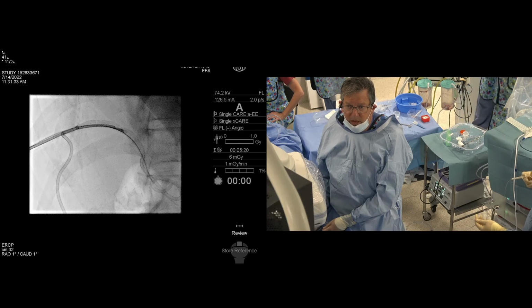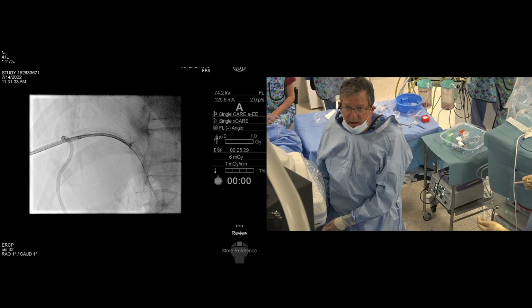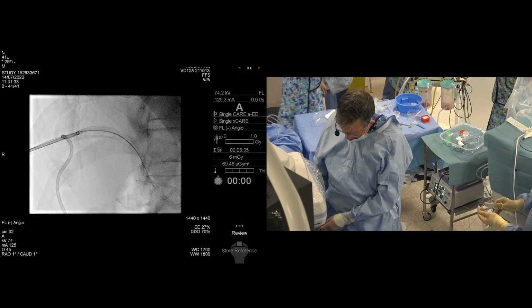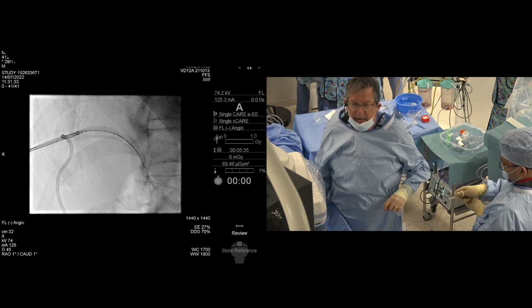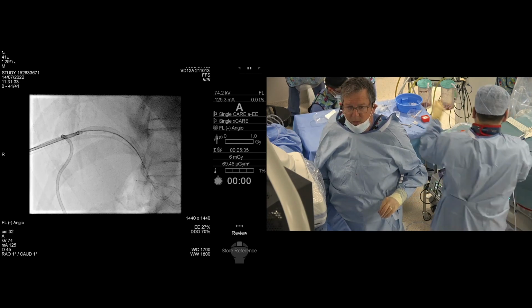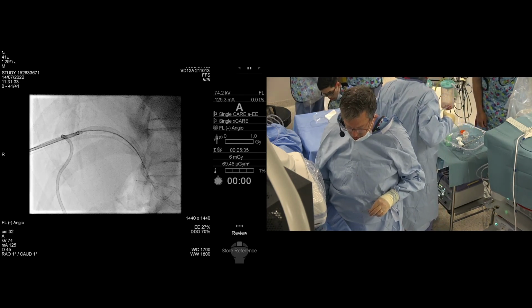Can we open the biopsy forceps, please? That's good. So you can see those jaws opening beautifully there. And close. And I've got a little tug there, which I like to feel. Good. Lovely. That's come out there. The other obvious advantage of this technique is that you can go backwards and forwards, taking multiple biopsies without the repeated anxiety about cannulation or reaching the stricture safely.